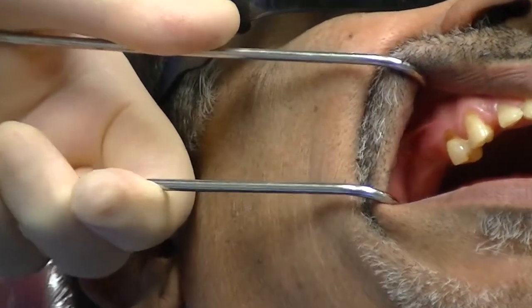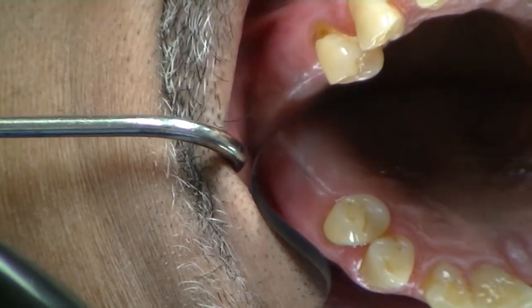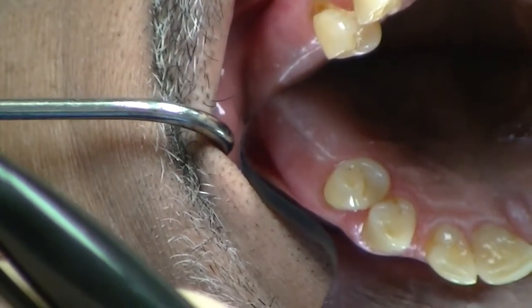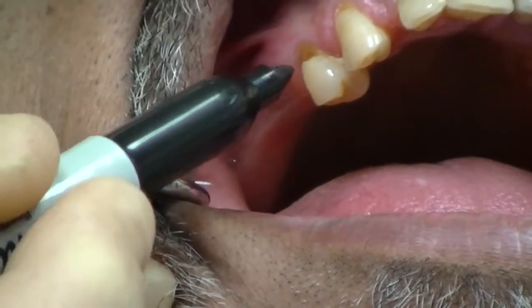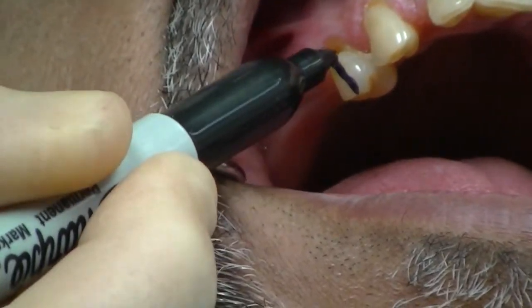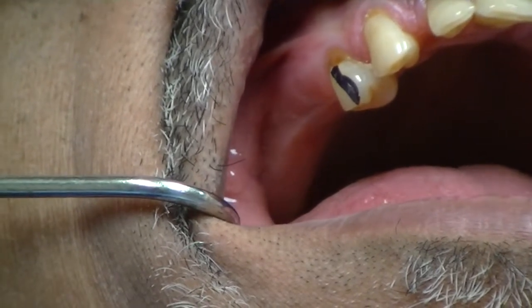We can see the edentulous space with good vertical width of bone. The adjacent tooth appears a little mesially-verted, meaning the root is slightly distally-verted, but this appears to be an ideal situation for a dental implant even without our CBCT analysis. What I like to do is draw — using a disposable Sharpie — a line that will help me visualize the angulation of the implant as I surgically place it, and also help with the emergence profile.